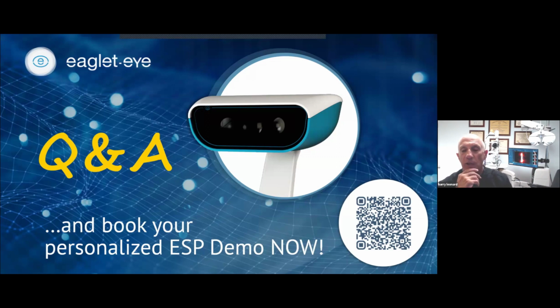But I definitely reach more for a scleral now, knowing how good of a lens we can make right off the bat. Because I am a referral center, I get the worst of the worst. A lot of people come in having failed with their small RGPs. They just aren't comfortable. Then I can say, here's why, and here's why we can do something more. I wore Rose K myself for years, and I'm much happier now with my sclerals, especially for sports.